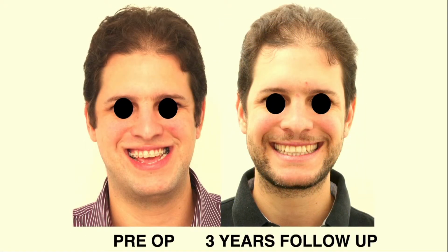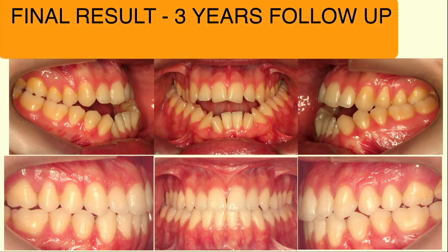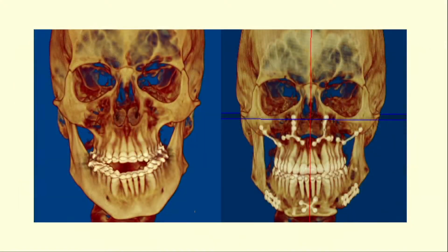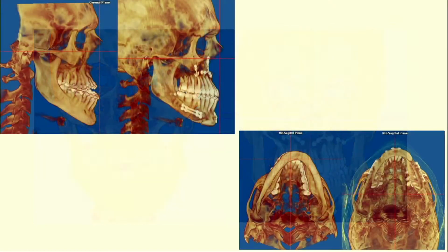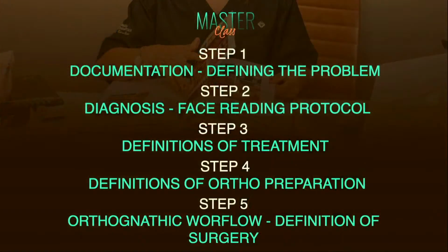And here is 3 years follow-up of this patient. The pre and post and the stability. Many times I have some kind of small discrepancy of the patient on the back because of the tongue and some function of this patient. But a very good case, the final result.